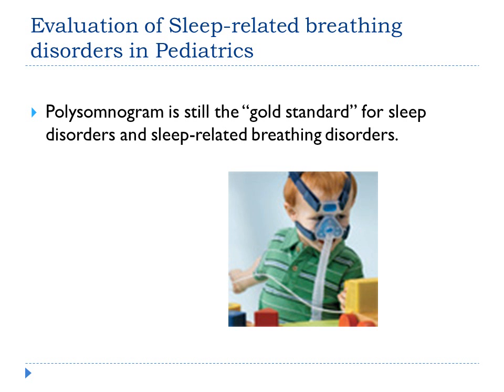The evaluation of sleep-related breathing disorders in pediatrics uses the polysomnogram. That is still the gold standard for sleep disorders and sleep-related breathing for both pediatrics and adults. Let's go on to our next slide.